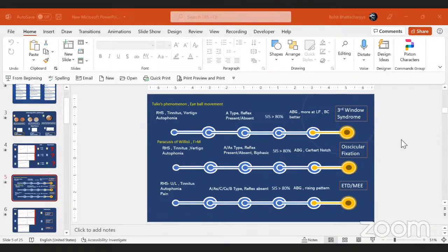Correct. Yes, sir, it's even better than zero. Because there's always a little bit of lower BC in case of ossicular fixation or any kind of otosclerosis. BC is very paradoxical in such cases, especially in case of semicircular canal lesions. And also it is a little bit paradoxical, not low BC, in case of ossicular fixation. There may be other causes which may cause the BC to be low. It may not be the cochlear otosclerosis, but as a whole, BC comes down in case of otosclerosis.